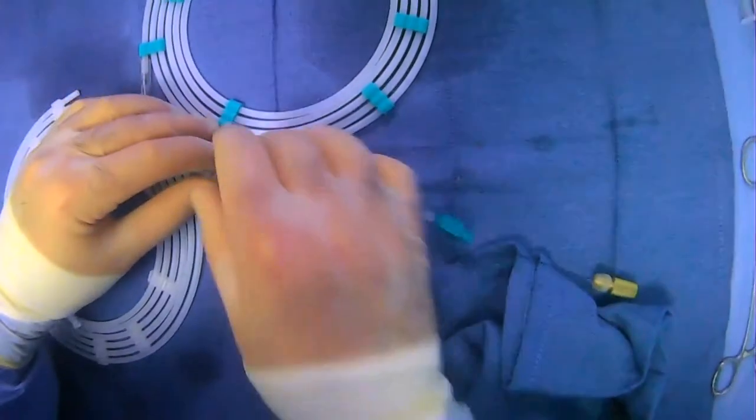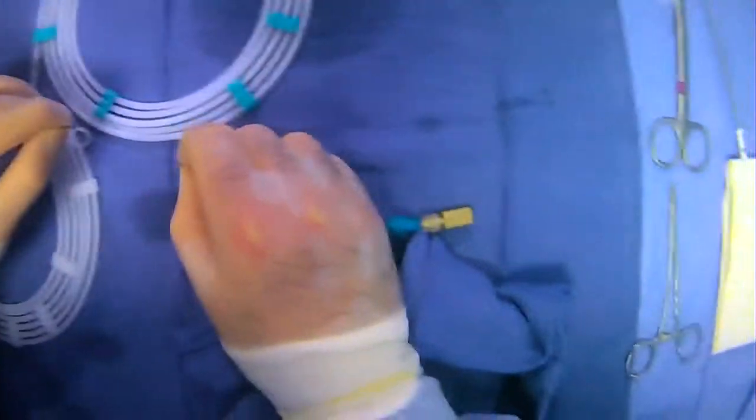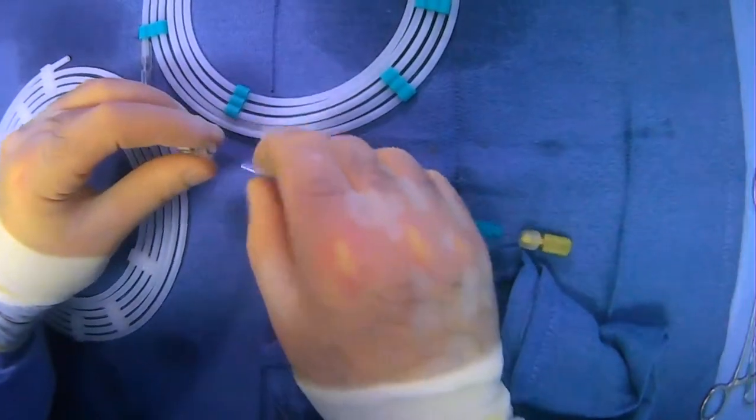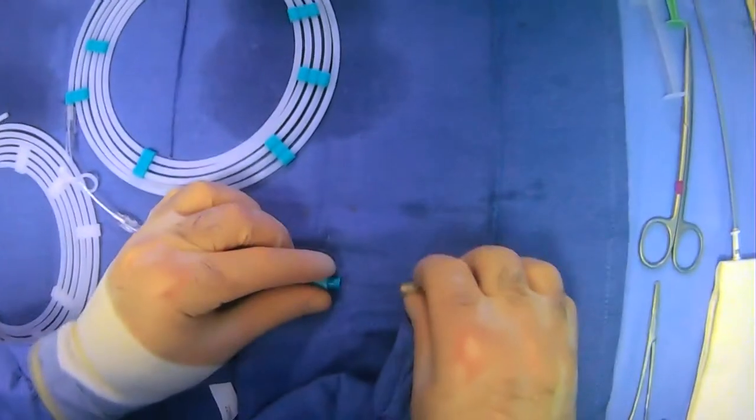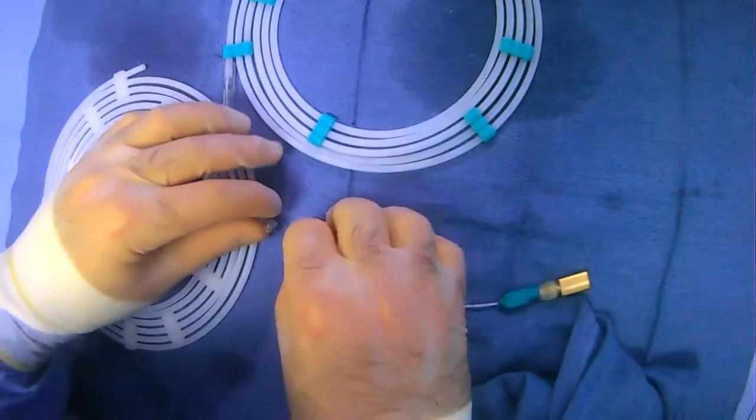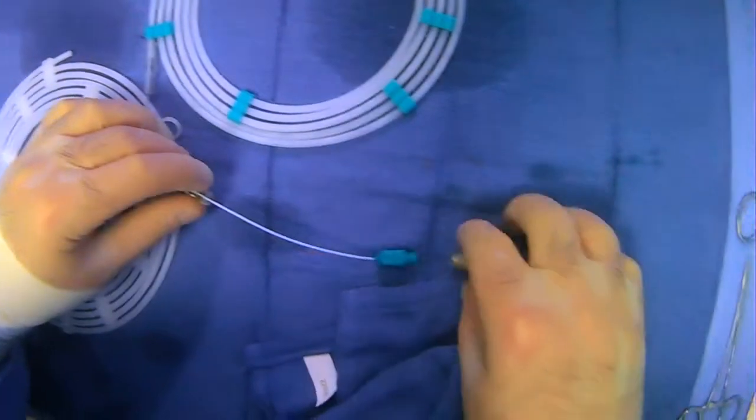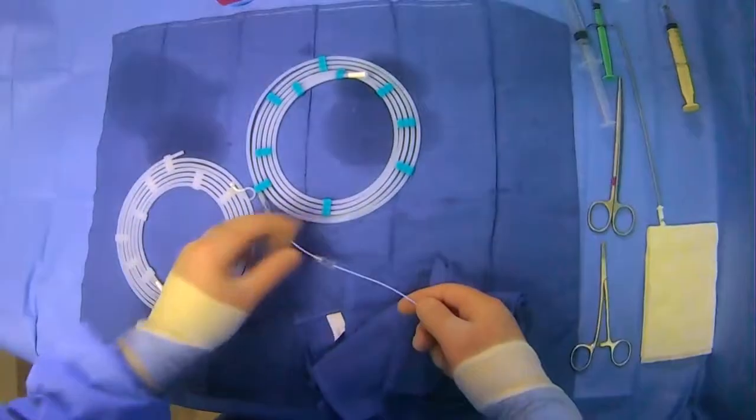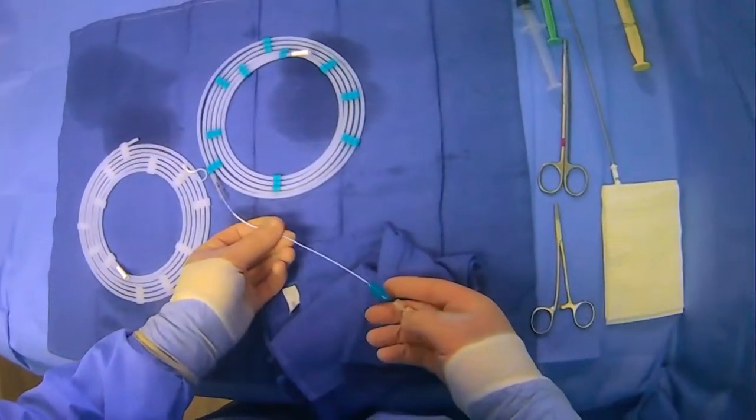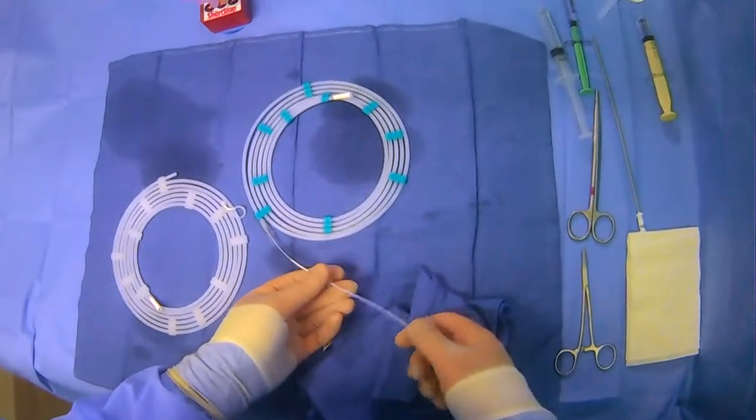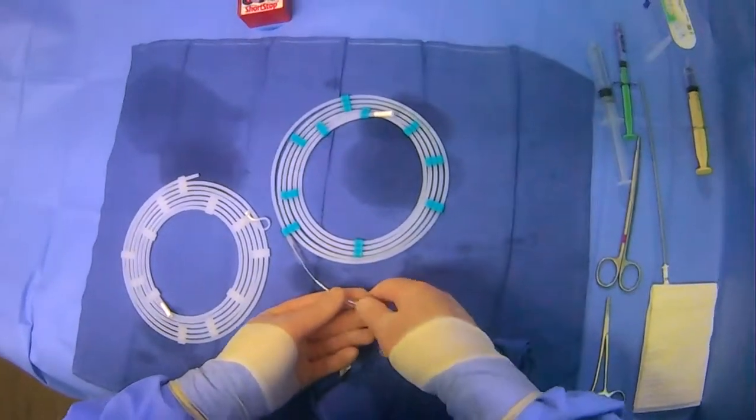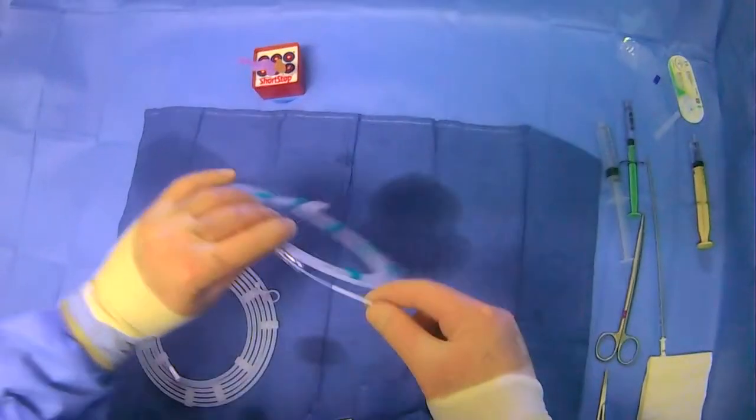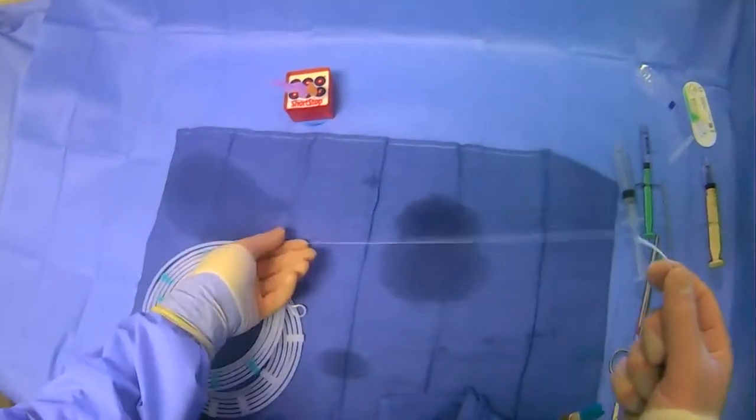So now we can bring everything in and hub it. There we go. Okay, so now we have everything in place. Everything's been flushed and we can pull out the microcatheter here.